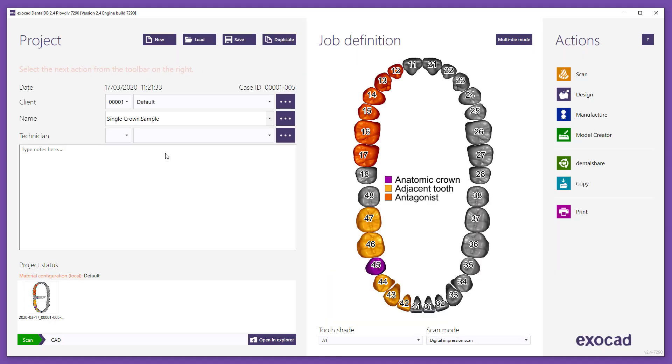If your partner uses their own material list for manufacturing, you can create the order based on their material list. If you choose a partner for design and another partner for manufacturing of the same project, you should create the order with the material list of your manufacturing partner.